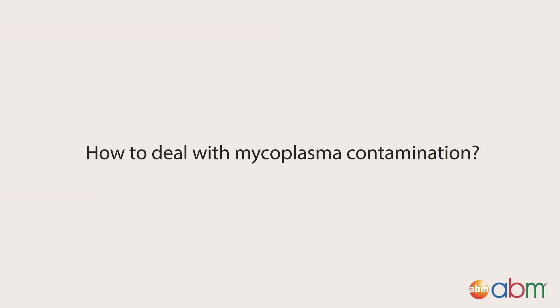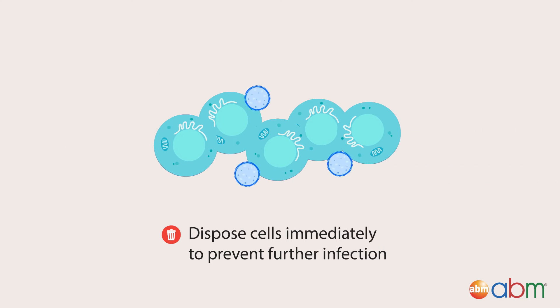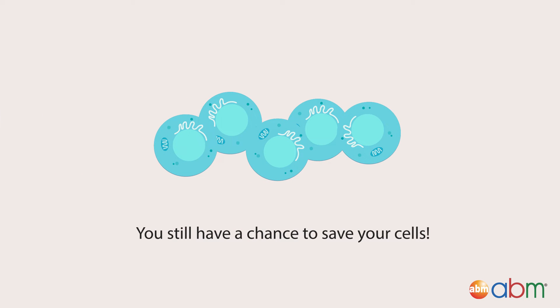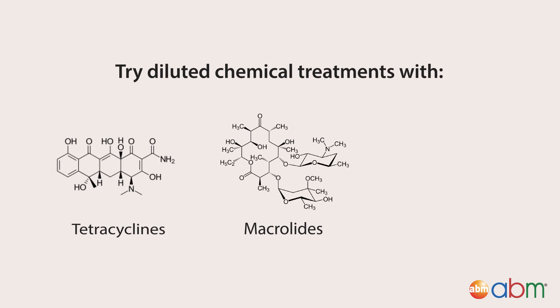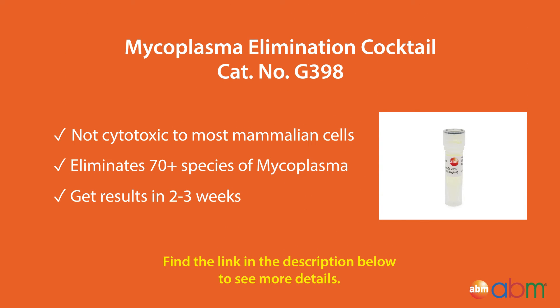So what do you do if you end up detecting mycoplasma in your sample? As always, it's best to discard contaminated cells as soon as possible to prevent other cells from being infected. But if your cells are too important to discard, there are a few ways to save them. Diluted chemical treatments like tetracycline, macrolides, or quinolones can be used to eliminate mycoplasma while maintaining the quality of your cell culture. ABM also offers a mycoplasma elimination cocktail that can effectively clear cells from mycoplasma contamination within a few weeks.